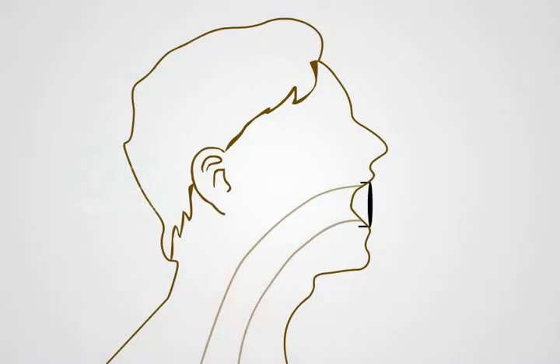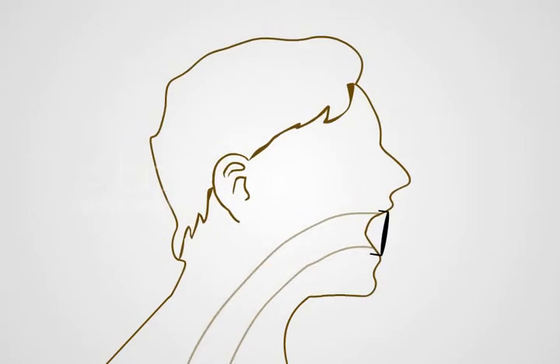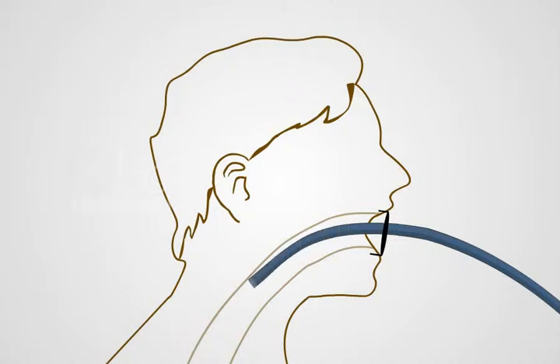The doctor will then ask you to put your chin to your chest and open your mouth. The doctor will ask you to swallow when the tube is pushed into your mouth. This will allow smooth insertion of the tube. You will be closely observed during the procedure, and if you choke, your doctor will spray more numbing medicine in your throat.